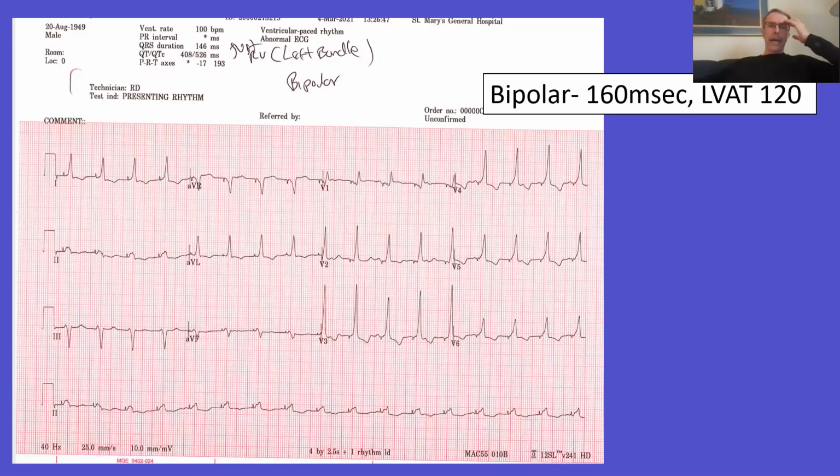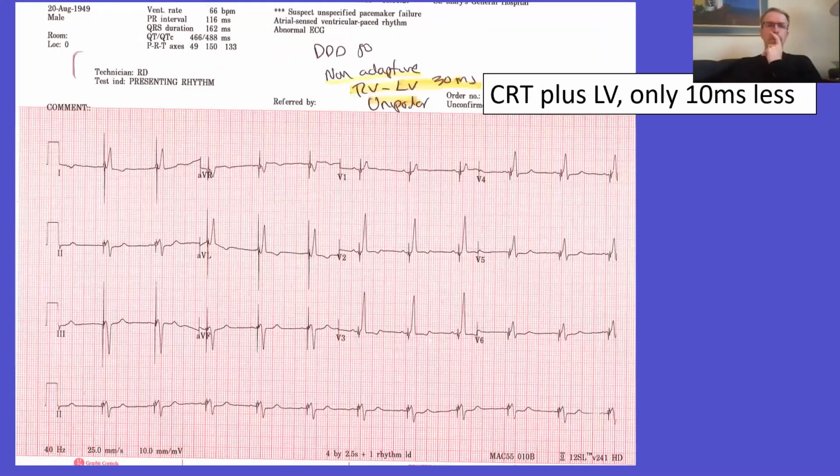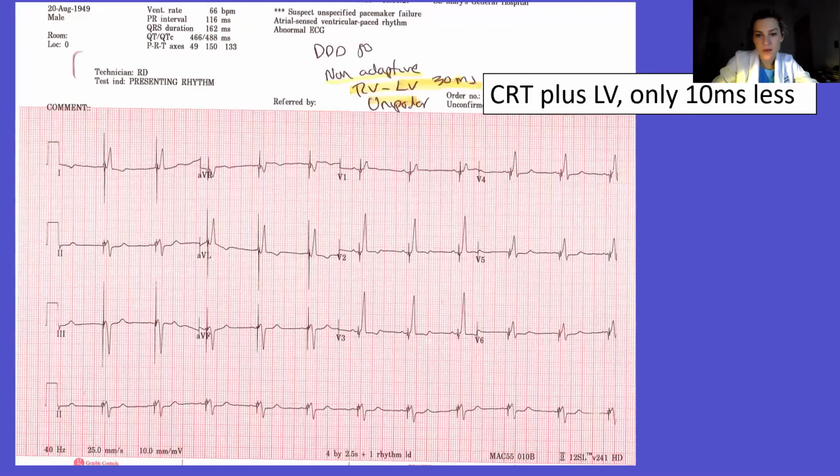So, yeah, the obvious question is, is it just not quite there? And with unipolar, I'm getting a bigger distance that I'm depolarizing. These were, however, at the same outputs. I'm going to show the next one because it was actually kind of cool. CRT plus LV, it was only 10 milliseconds less.